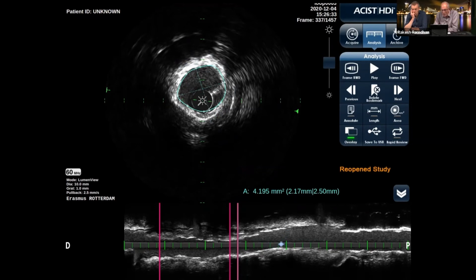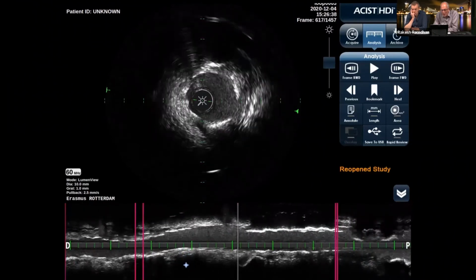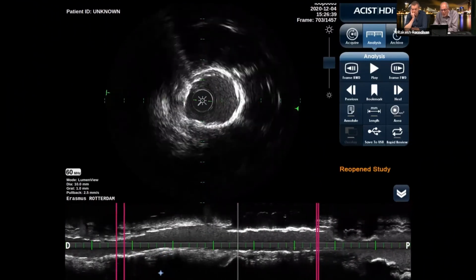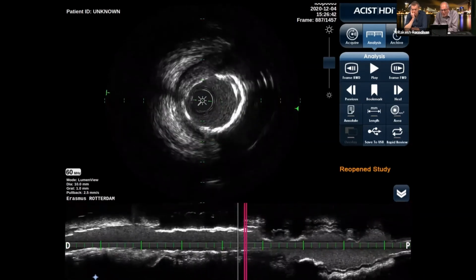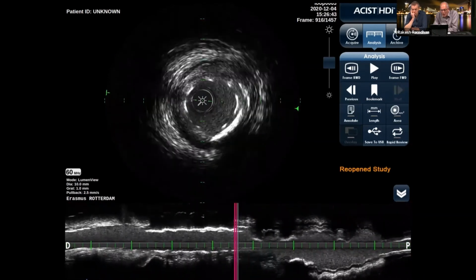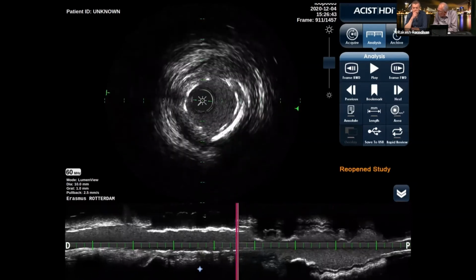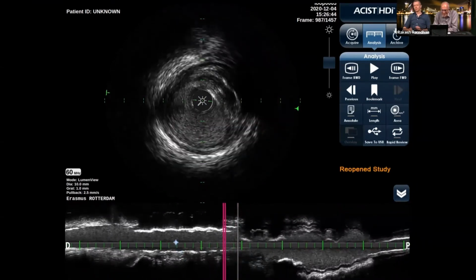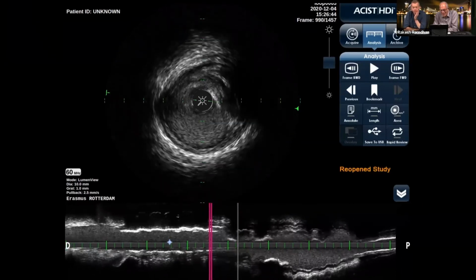And if we go more proximal, then you see the size of the stent. Also here, there's still calcium in there. And then more proximal, also here we have an underdeployed stent. What was the size of the stent? The stent was a 3.0/33 millimeter DES. And this is a beautiful example of how you can use imaging but not use it properly.